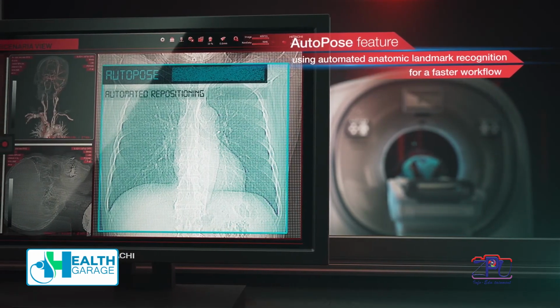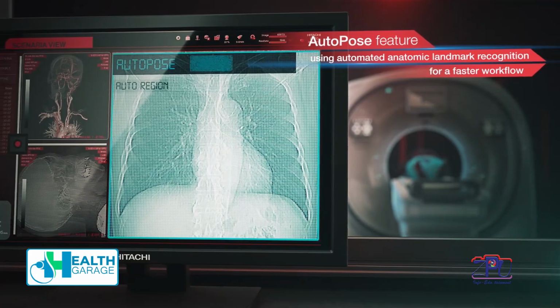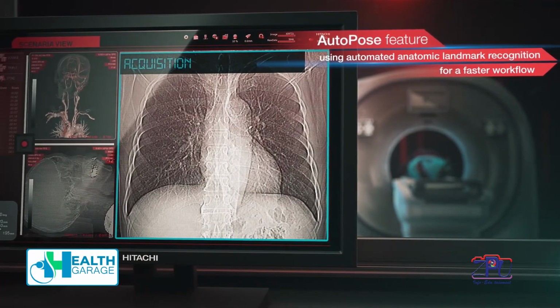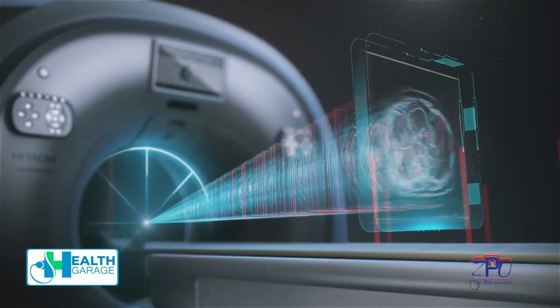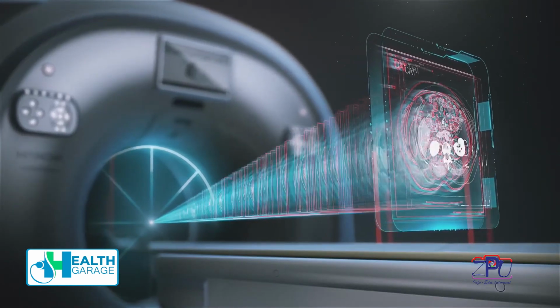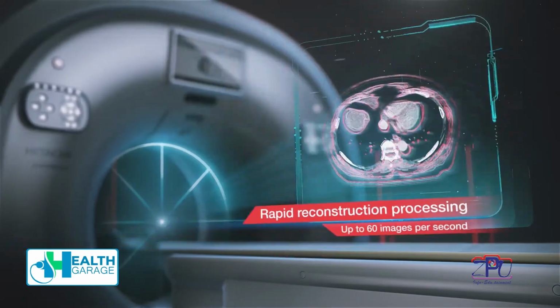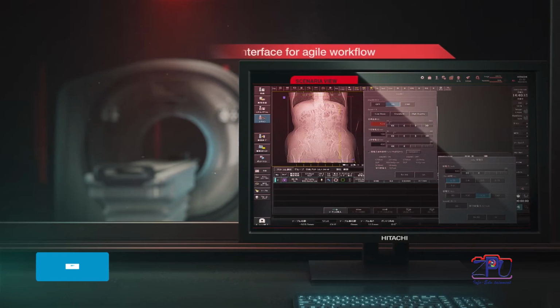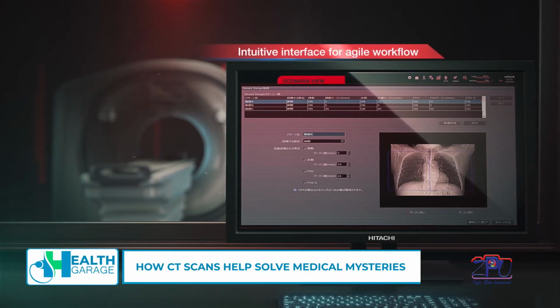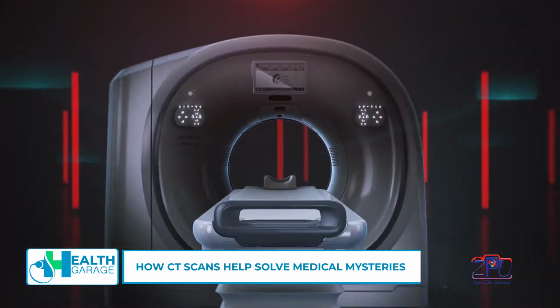Let's say in the head, we can just do imaging of the brain, different parts of the brain. We can also go ahead just to look at the vessels of the brain and diagnose different diseases. We can diagnose aneurysm and other AV malformations and other conditions affecting the vessels. The same holds true in the rest of the body parts.